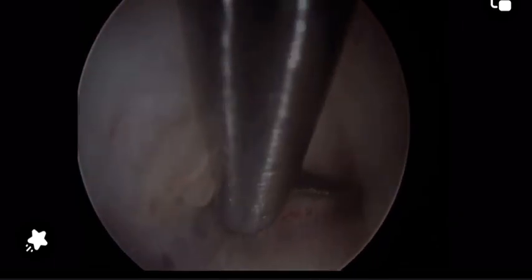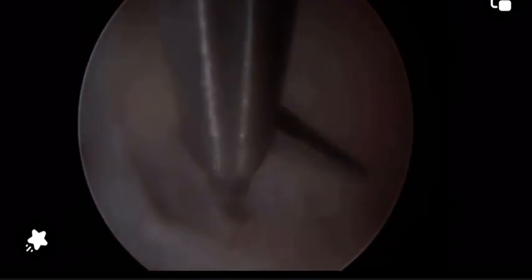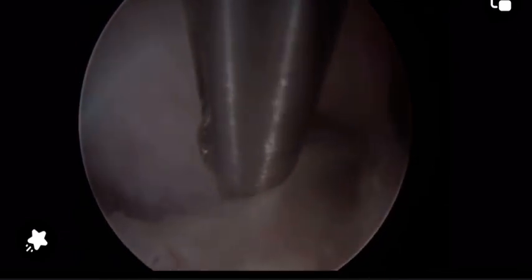Again, if you use the blade to cut directly, the cutting might not be sharp enough and the tissues might not retract. So open the blade, push on the tissues, but it should be a gentle push, not too much push, otherwise you perforate. Just this pushing by the open blades allows you to exert tension on the fibers of the septum, so when you close the blades, it cuts more perfectly.